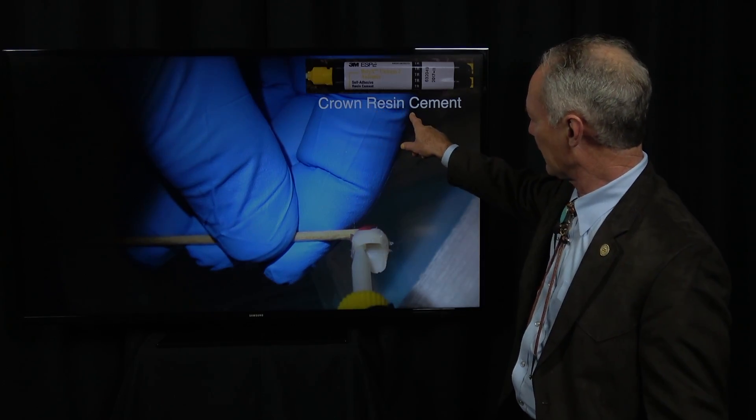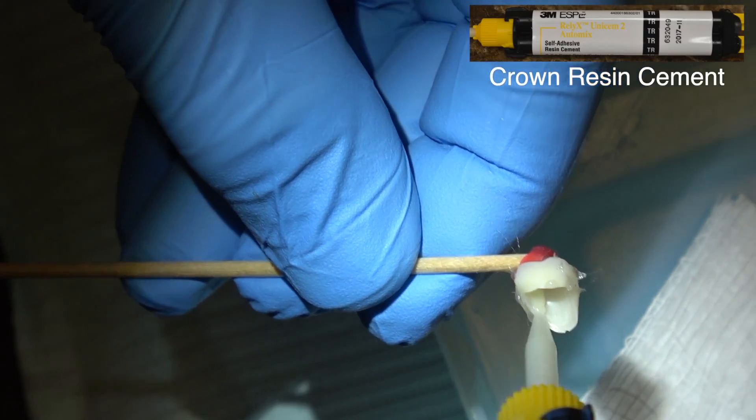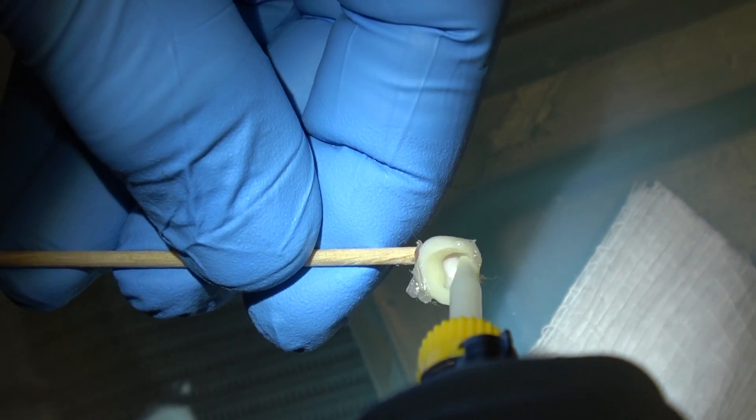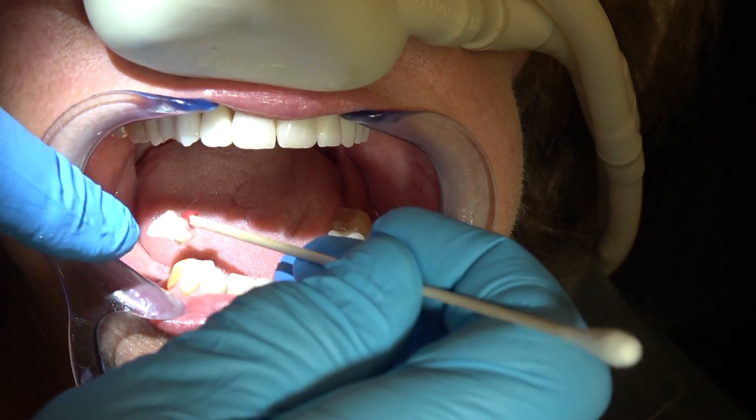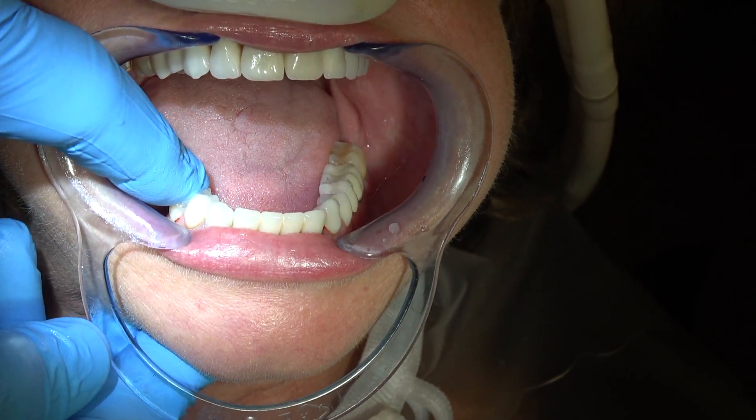Placing our cotton tip applicator with red rope wax and then putting Vaseline on the interproximal contact so it makes it easier to remove the excess cement. Then we're squirting our resin cement just around the margin. Don't fill the crown up or it won't seat. Squirt it just a thin layer around the margin — this is all you need. We've seated both the crowns, pushed into place.